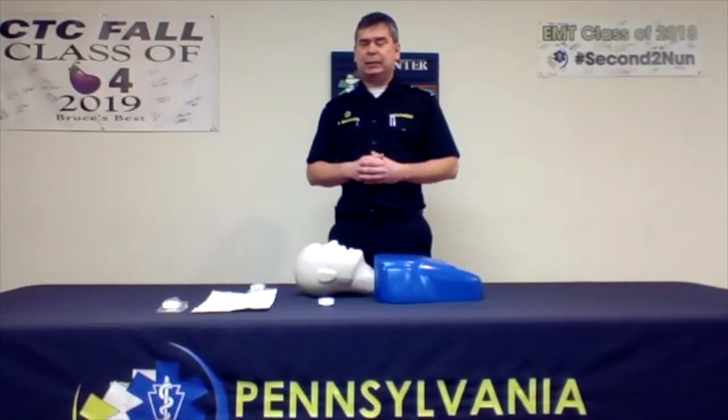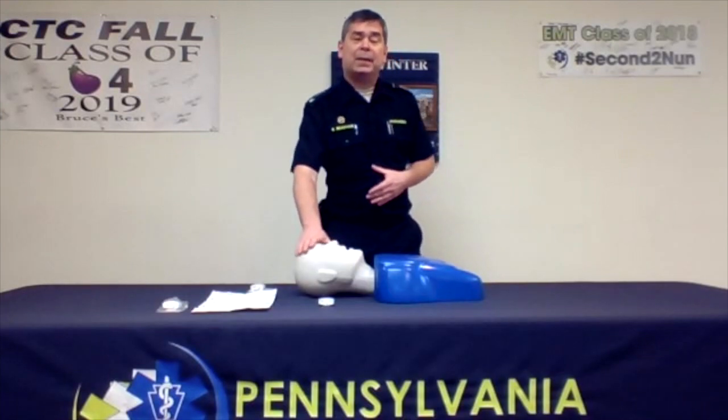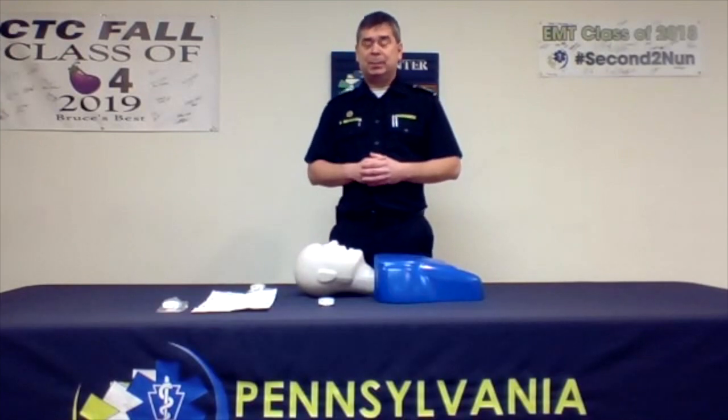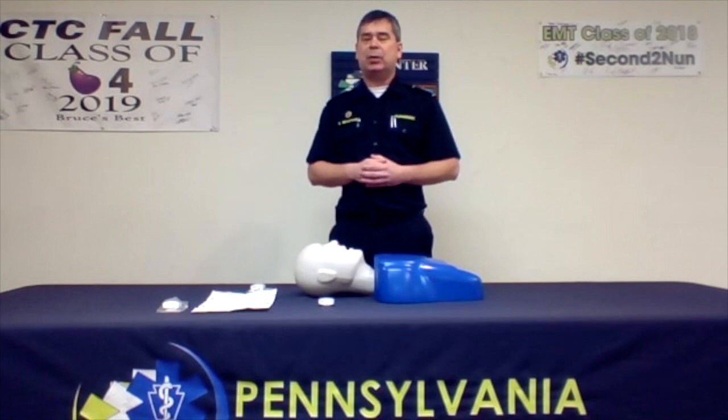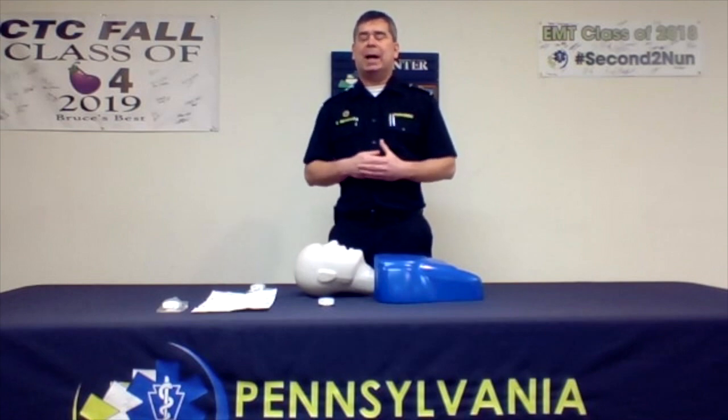To administer this drug, we must ensure that there are no trauma mechanisms noted to the nose. The nose is how we are going to administer this medication, so any damage to the face or the nose that prevents us from placing this into their nose will not allow this drug to be used effectively.